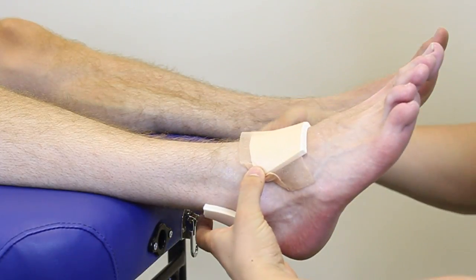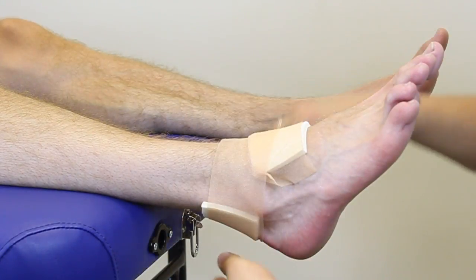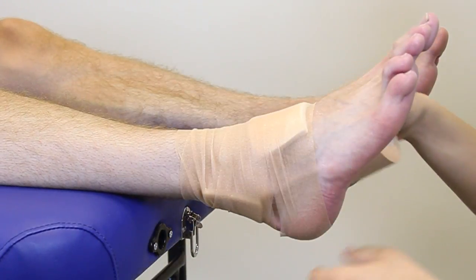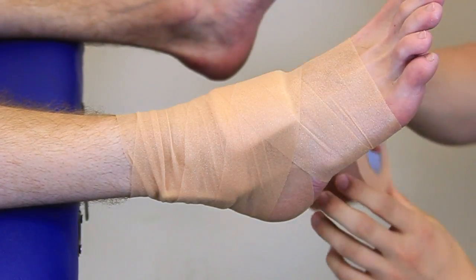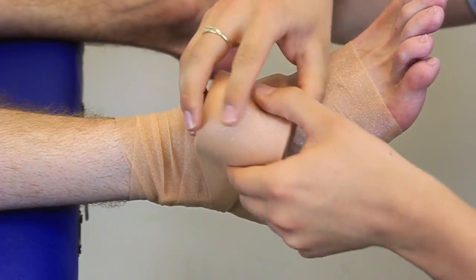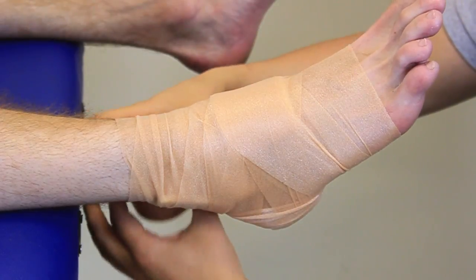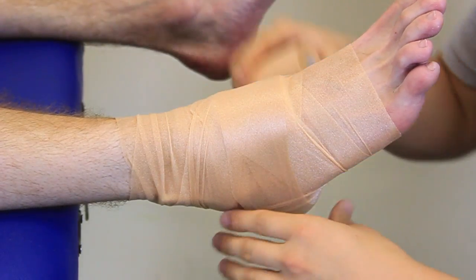Once stuck, we're going to apply the underwrap over the top, going around the ankle and the lower part of the leg. Make sure we're coming around the back as well — we want to make sure that the heel is covered. Then going a good way up the top of the leg so we can put our anchors in.